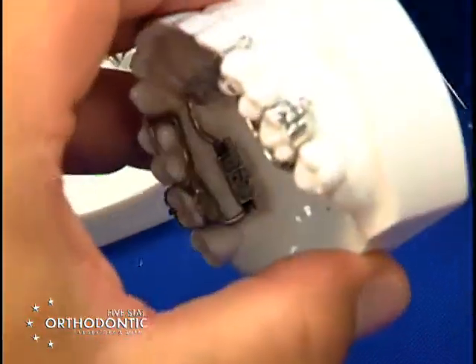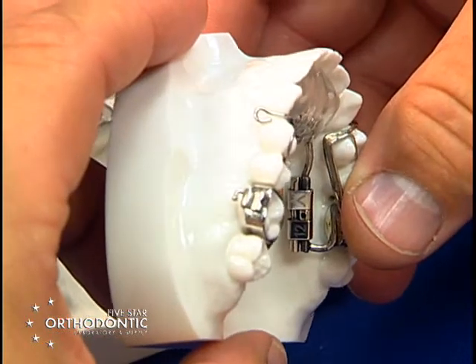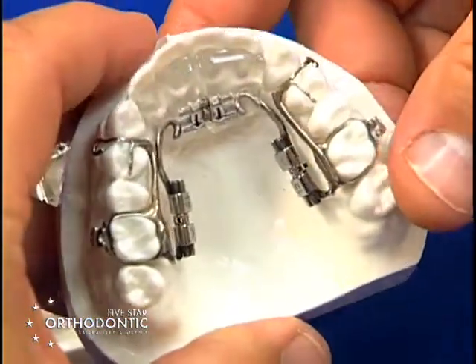You can add auxiliary springs to any of these appliances. These are tandem appliance hooks for class three patients.